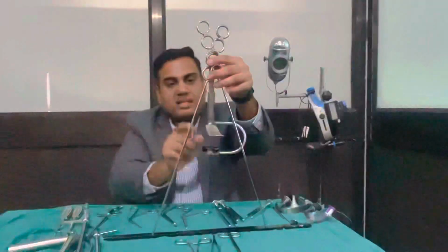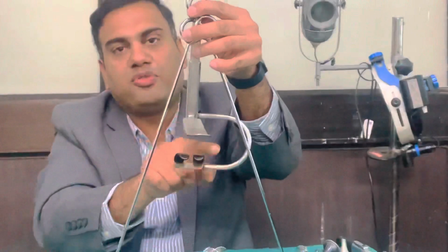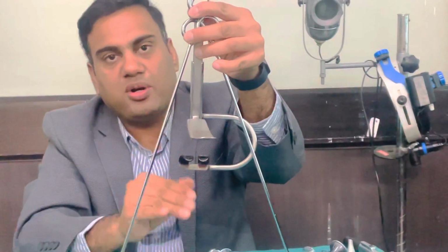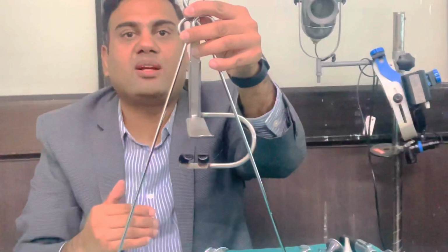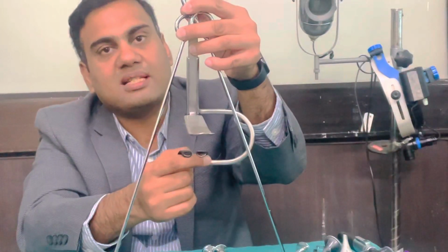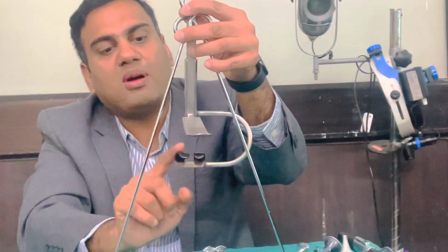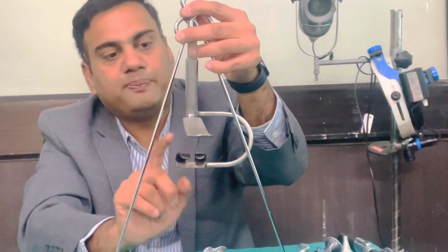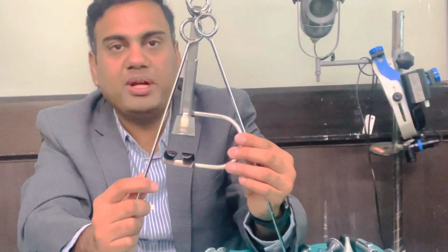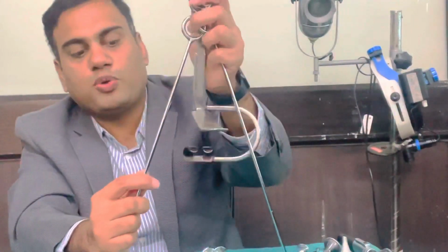This is the area through which we are going to remove the tonsils. The tongue is elevated up and the central incisors are down, because the patient is lying down and we are standing on the head end of the patient. Remember, again, this is levered on the central incisors. To avoid any kind of trauma, we have kept some rubber tubing over here. This is the basic setup of doing a tonsillectomy in Rose position.